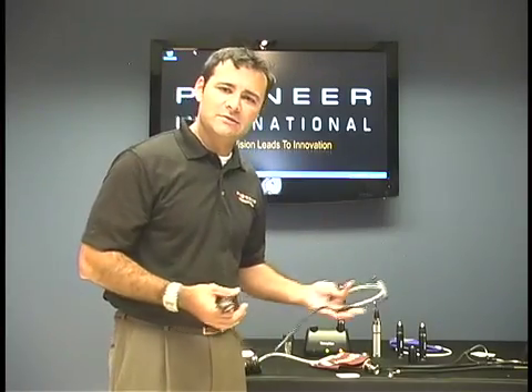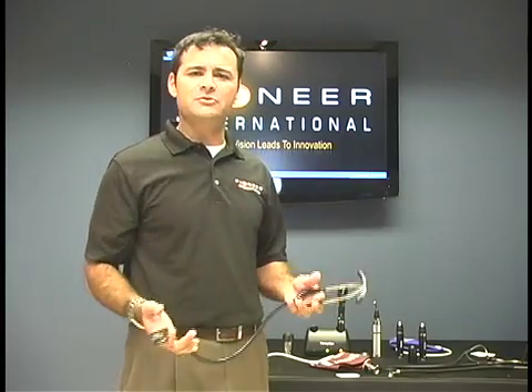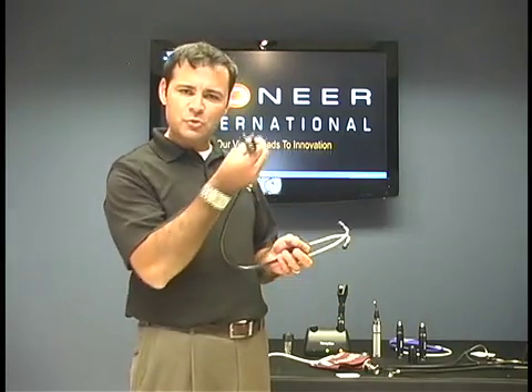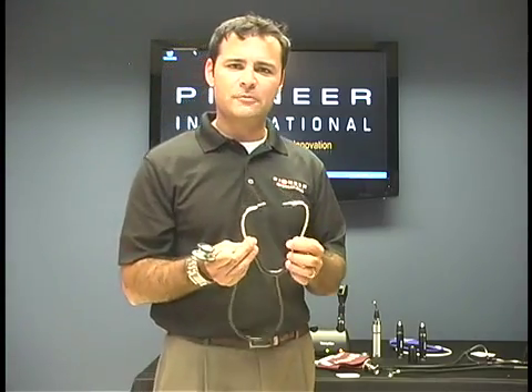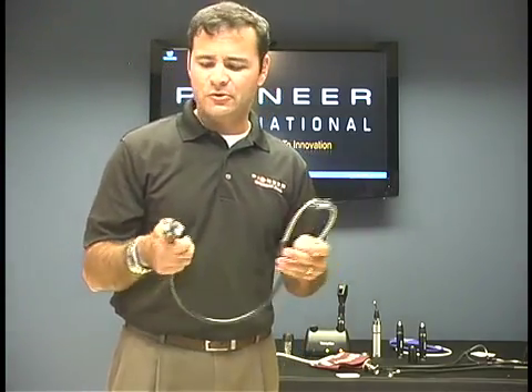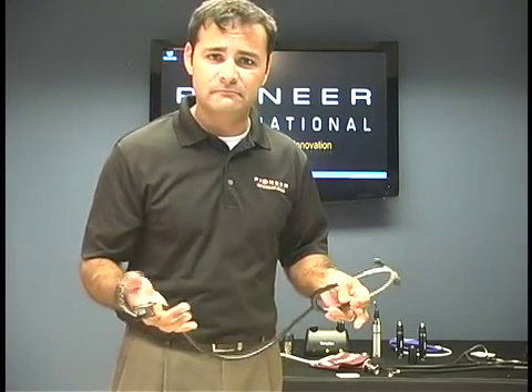Now that we've finished up with the DLX and the Harvey Elite stethoscope — again, this is going to be your FM stereo sound with two tubings going through the single piece. This is going to be more of a nursing grade stethoscope. It's called the professional — the one that I'm holding — and it has a single tube that goes through. So unlike the FM stereo sound, this is going to be more of your AM sound.